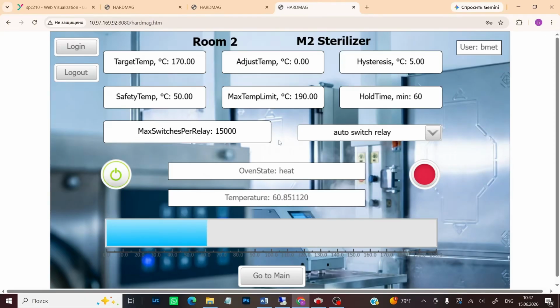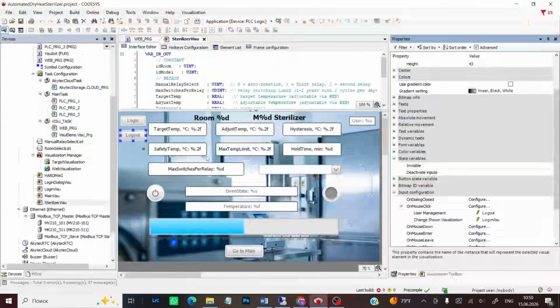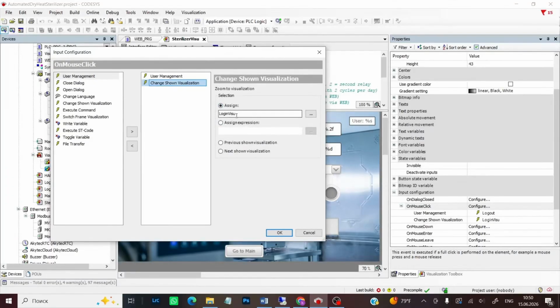As a result, I would end up on the main user login page, which, as you can agree, is not very convenient. To navigate to the main authorization page, I added a second function, Change Shown Visualization, to the Logout button as an event handler for the click event, and in the Assign field, I linked the corresponding visualization.